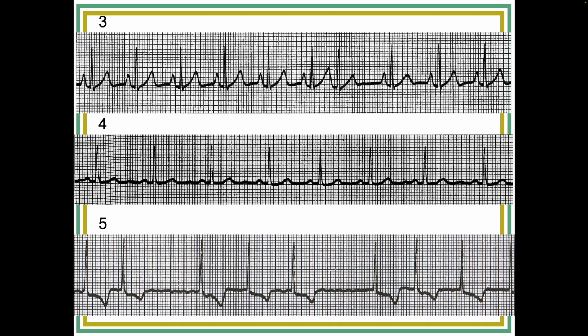Irregular. Okay, so what's the rate? And 6 second will work best for you. You got 7. Yeah, 70, 75. Yep.